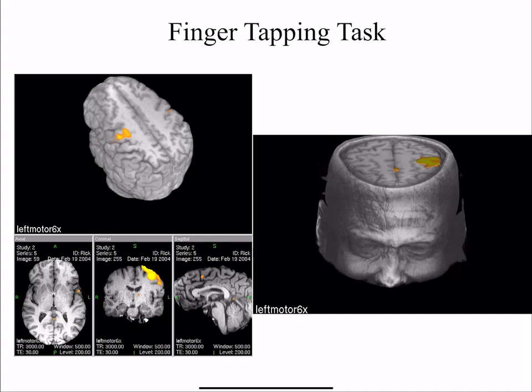Then you can take your activation maps and superimpose them on the 3D anatomical image. You can surface render it. You can make lots of cool photos. I know some groups, after the MRI is done, when you take part in their study, actually 3D print the brain for you and you can use it as your keychain or something like that. So that's sort of cool.